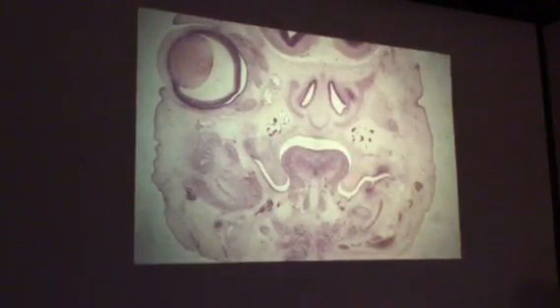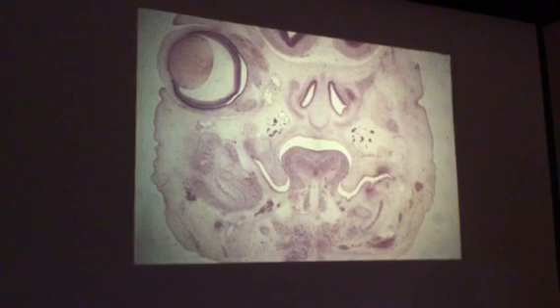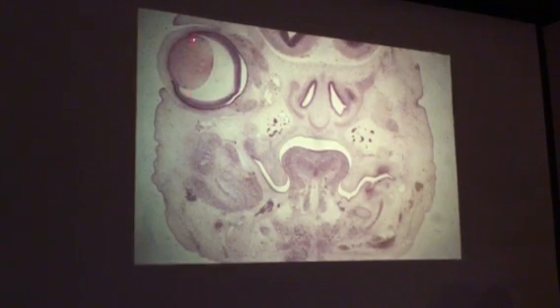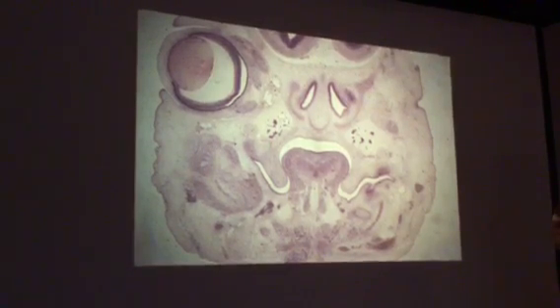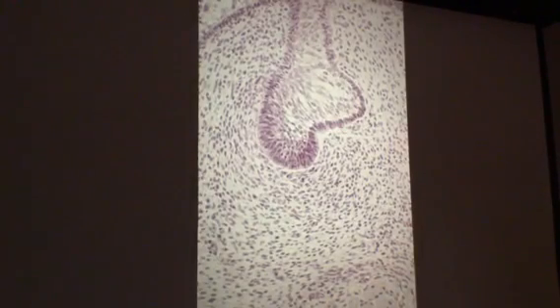Okay, and that's a little shelf. There's the tongue. You do not need to know the extrinsic muscles of the tongue, but it's kind of useful to look at those and consider what you're learning in gross anatomy as well. There's the developing lens right there. There's the developing retina. This comes from surface ectoderm. This comes from neuroectoderm. Did that slide somehow miss the other eye, or is it missing the eye? Yeah, it missed the other eye. If we had a cycloptic pig embryo, the eye would be right in the middle.